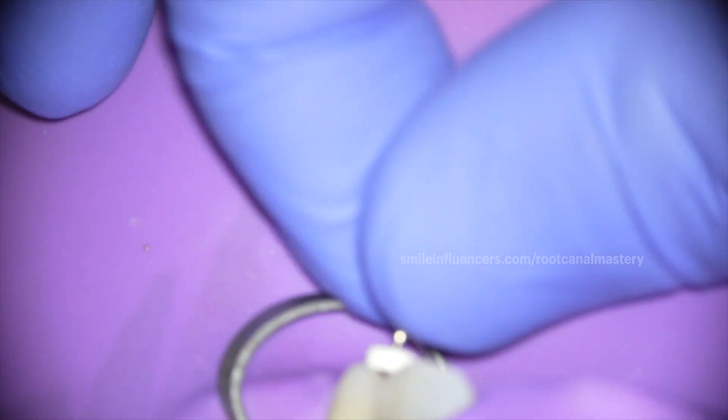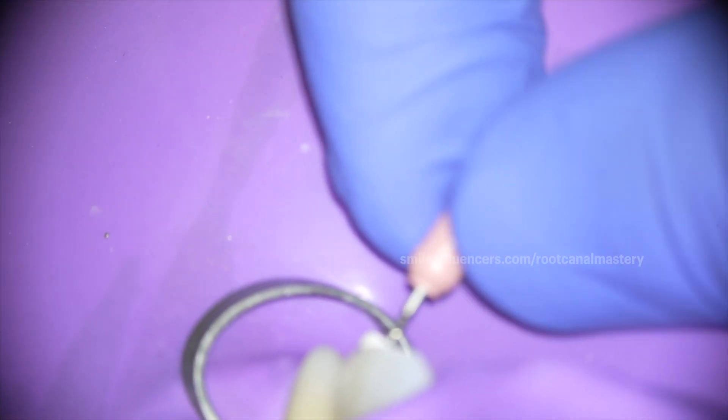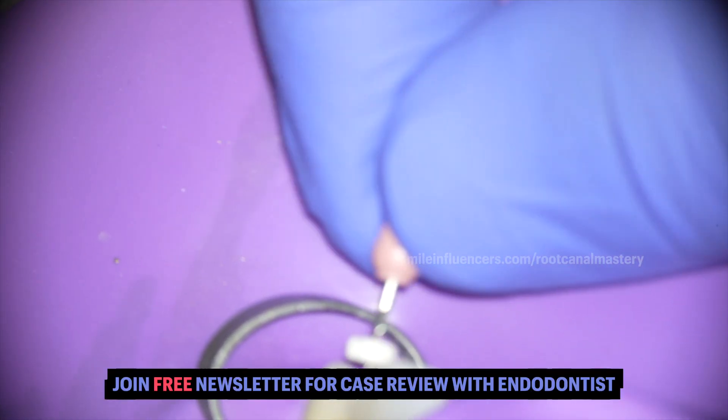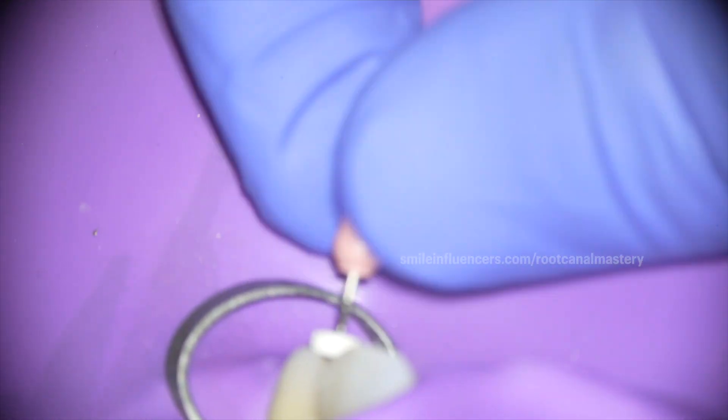Here, because I'm not engaging the whole way — I already pre-measured on the CPH roughly around 22 millimeters. Okay. So some ways to go on this side.